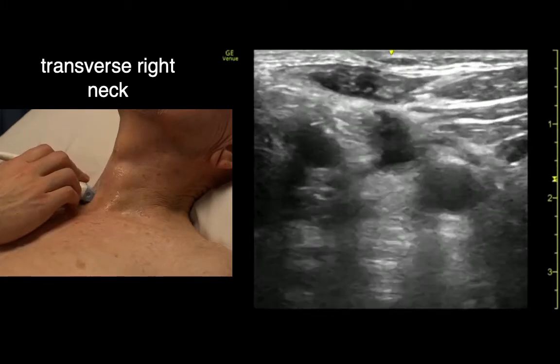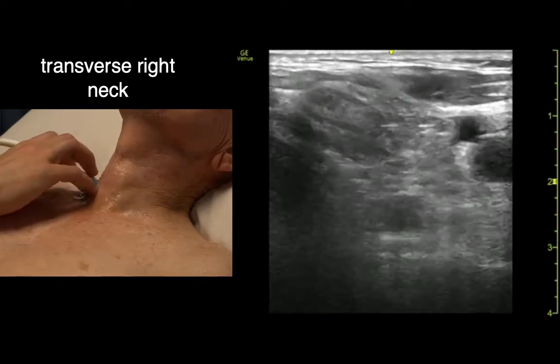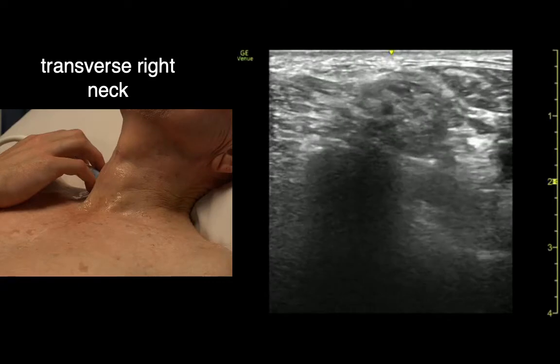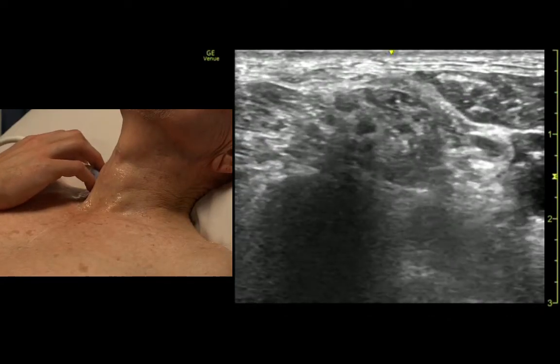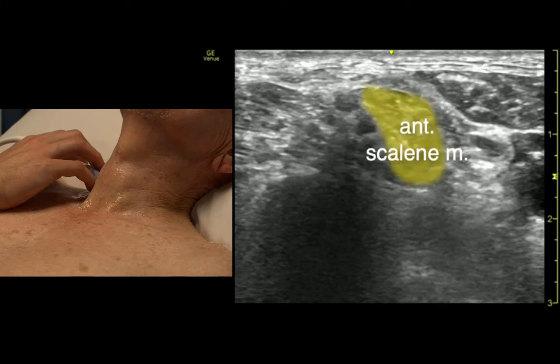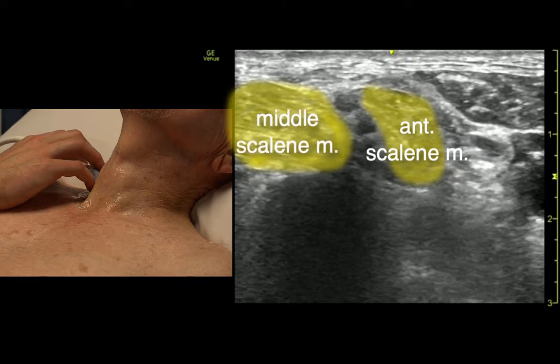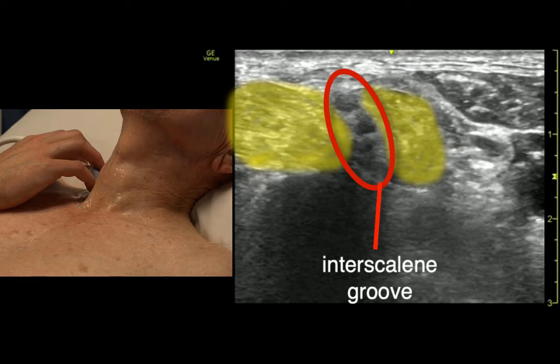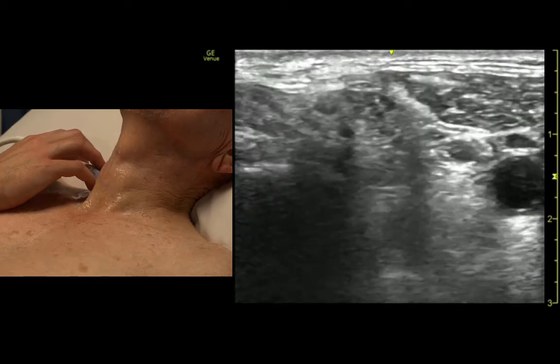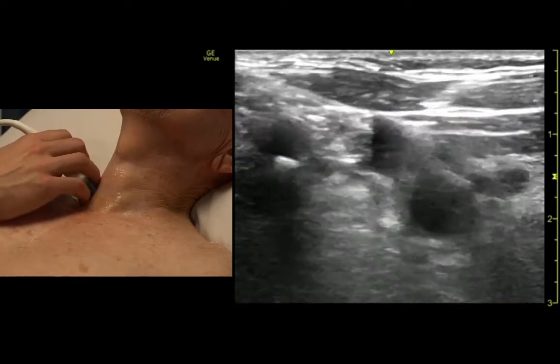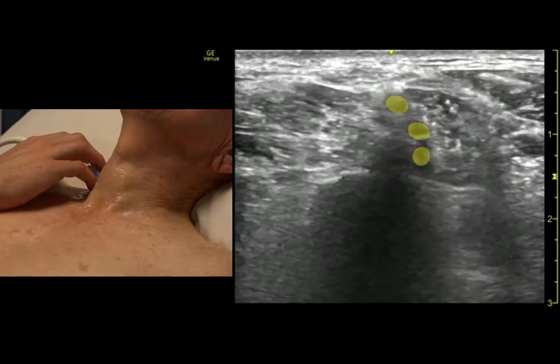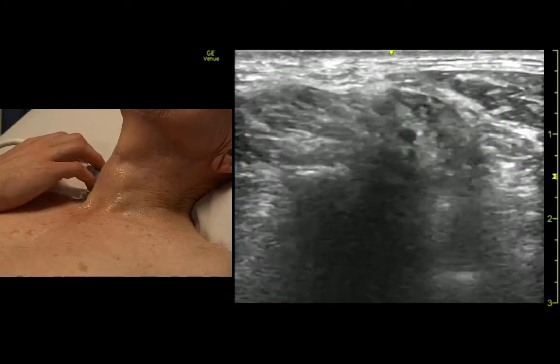There's the carotid and that's the IJ. If we follow back a little bit, we can find the interscalene groove. We might care about that to inject it and do an interscalene block. If I ever get lost, I just start low on the carotid — the first big muscle behind the carotid is the anterior scalene. If I can find that muscle, I can see the three big structures there — those are the trunks of the brachial plexus.